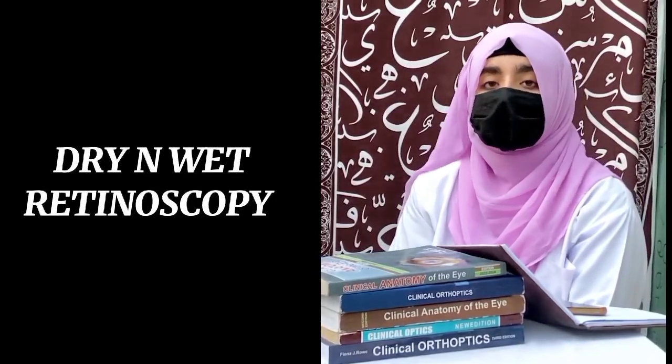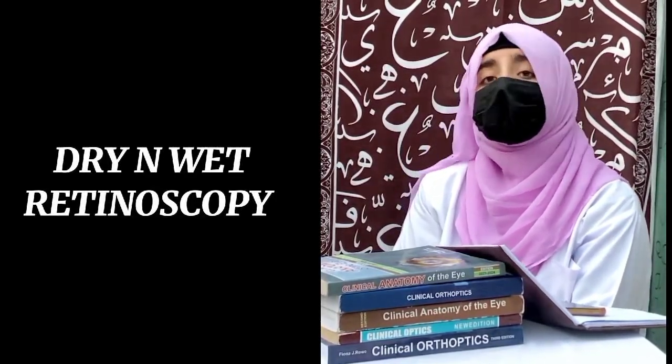There are two techniques to perform retinoscopy: wet retinoscopy and dry retinoscopy. In wet retinoscopy, cycloplegic drugs are used, which cause paralysis of accommodation and dilate the pupil. And dry retinoscopy is performed without cycloplegic drugs.